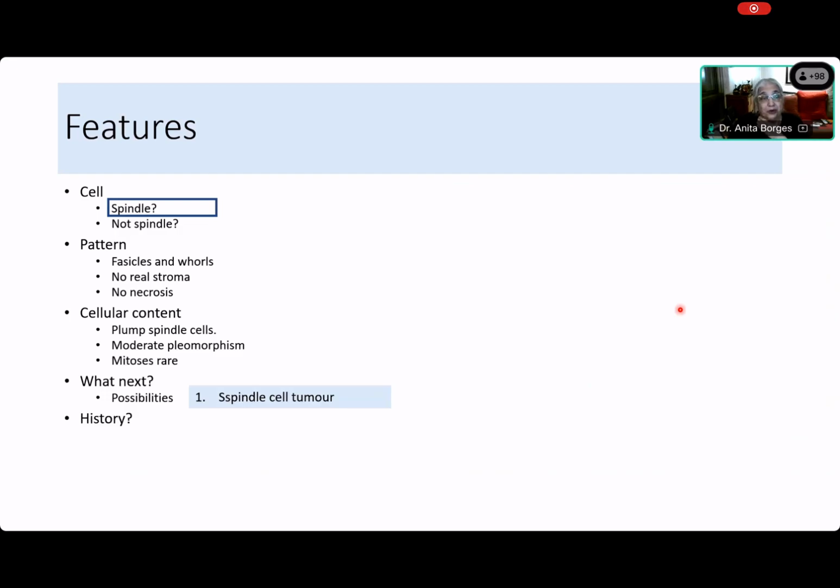Because we don't know. We take a history, it's retroperitoneal, and in this case, it was in the lower retroperitoneum. Okay, you have to ask that. So educated guess, I'm sorry, but there is no guess that is possible at all. All you can say is that it is a spindle cell tumor. You don't even know. There are no mitoses. There's nothing. Is this some low-grade sarcoma? Is it a benign tumor? Well, we can't say anything. So what next? We do immunohistochemistry.